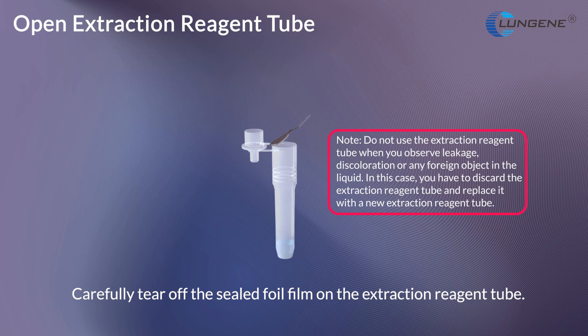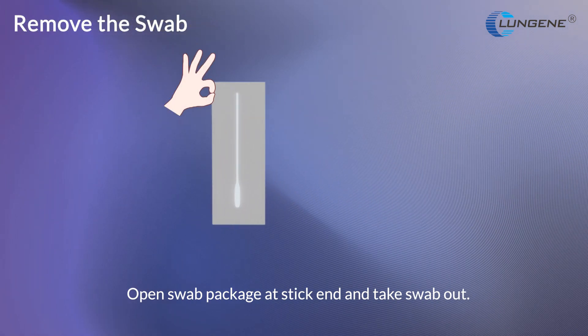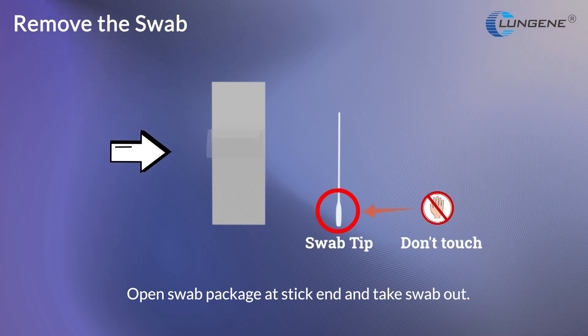Carefully tear off the sealed foil film on the extraction reagent tube. Gently press the tube through the perforated hole in the box. Open the swab package at the stick end and take the swab out.